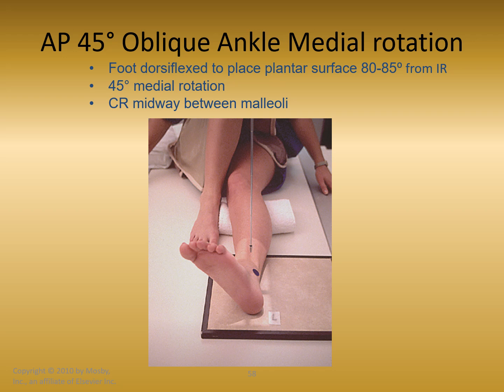We don't want to get into the habit of leaving the legs straight and then having them turn their foot in, because that's not going to turn those malleoli, because those malleoli are part of the tib fib, not just the foot, right? They're not part of the foot, they're part of the tib fib. So the lower leg needs to make the rotation in these obliques. So 45-degree medial rotation, big toe rotating in towards the body medially. Medial rotation, it is an AP projection on the oblique positions.